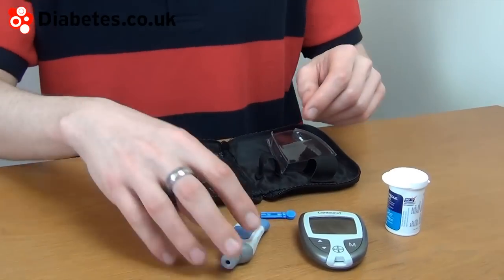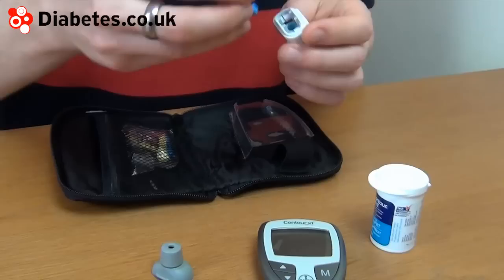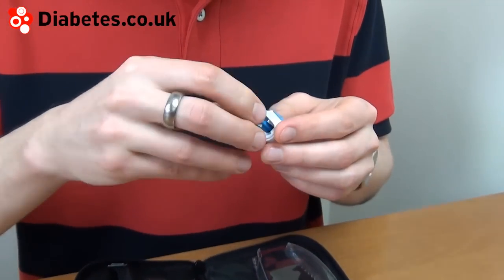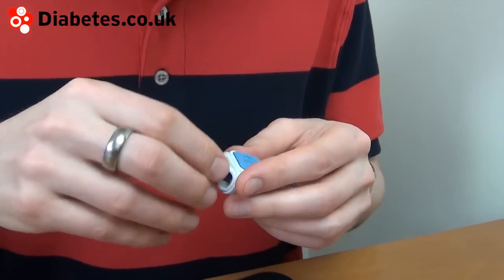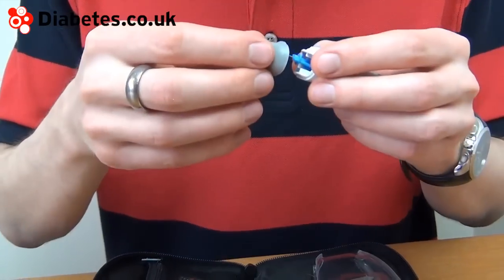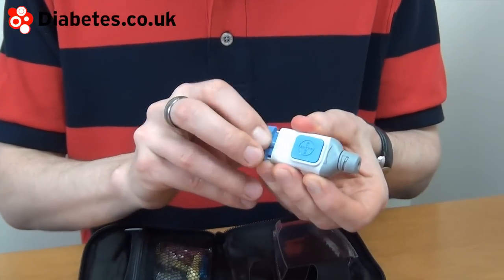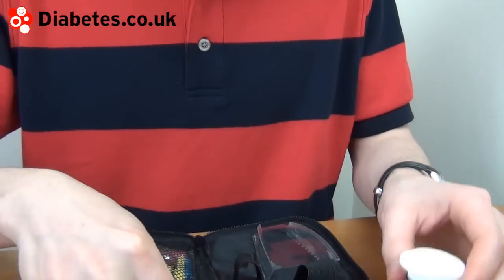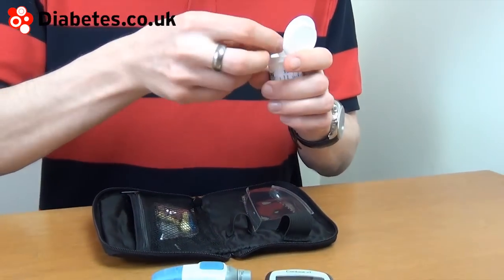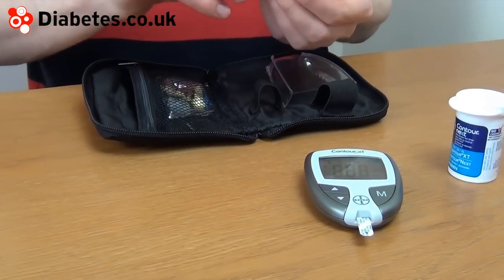So let's take the Contour XT through a test. I'll start with a new lancet. I've got some quite bright colours on the lancets from Bayer. This is the Microlet 2 lancing device. Put the test strip in and the meter starts up.